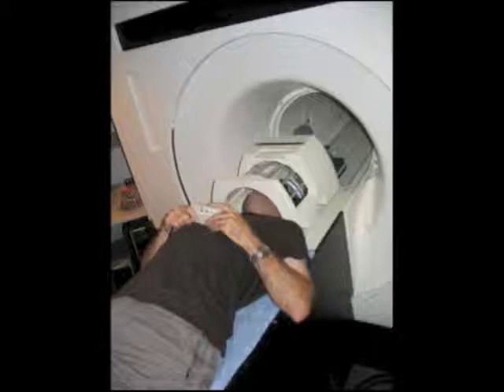Now the experiment that's used to introduce some principles of fMRI in methodology 6.2 is a simple button-pressing experiment. Here you can see a subject about to be slid into the scanner. The birdcage head coil has been slid over his head and in his hands he has a response box with buttons on it.